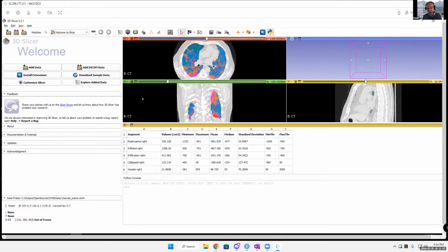I've used it for hours for analyzing bigger data sets. I show some results later.